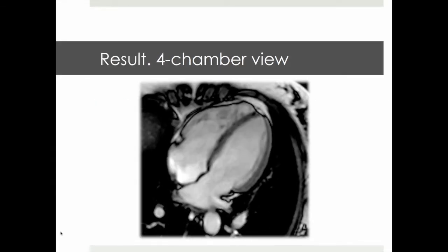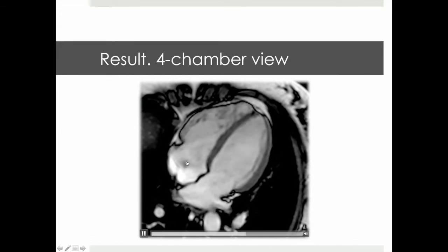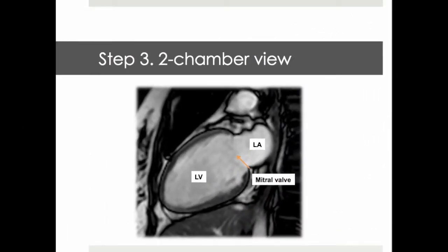And here comes our 4-chamber view, allowing visualization of left ventricle, right atrium, as well as left atrium, interventricular septum, as well as interatrial septum, mitral valve, and tricuspid valve.